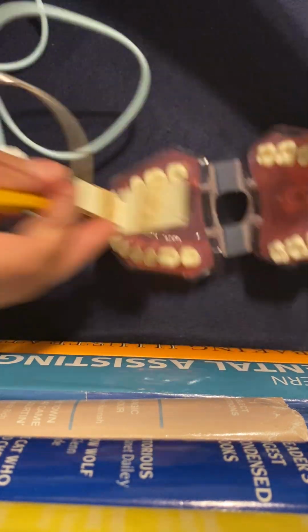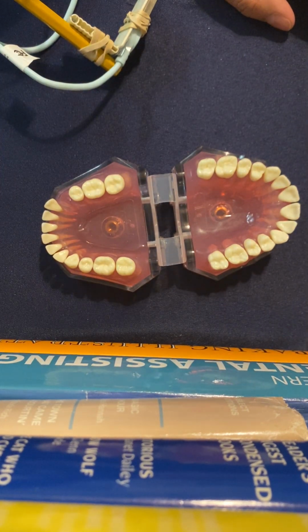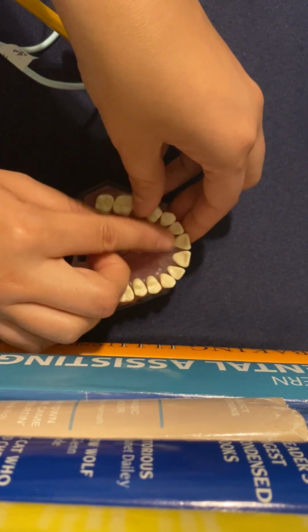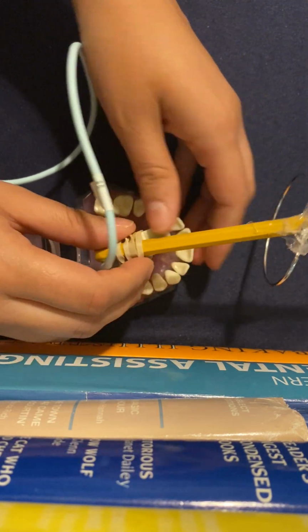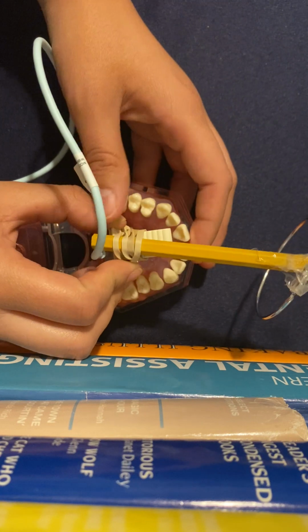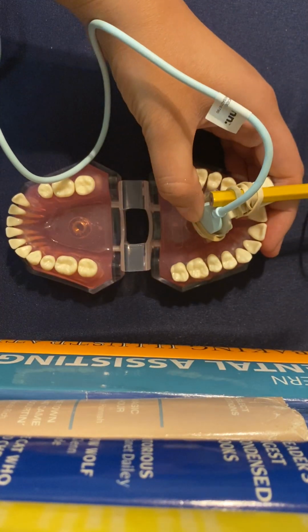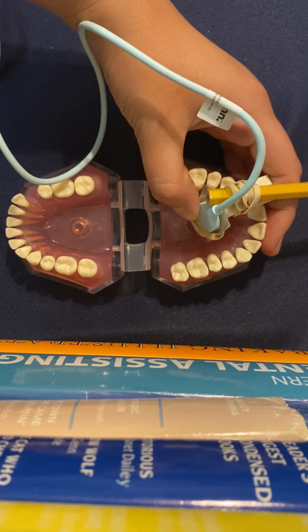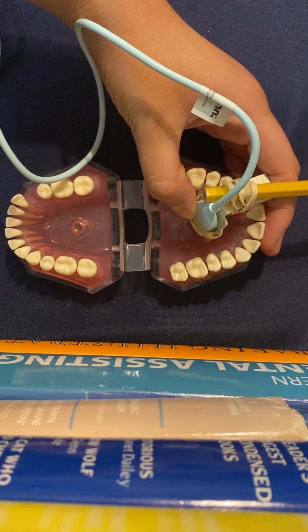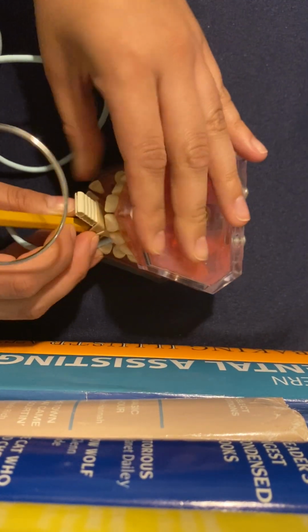All right. Number 2, you're going to want to do the maxillary central incisor. So you're going to want to get these teeth. I don't know if I mentioned this earlier, but you want to be parallel with the teeth, if at all possible. So you're going to want to center with the central incisor contact point, and the teeth you're going to want to see are the mesial, distal, and the apices. And just close that bad boy up.